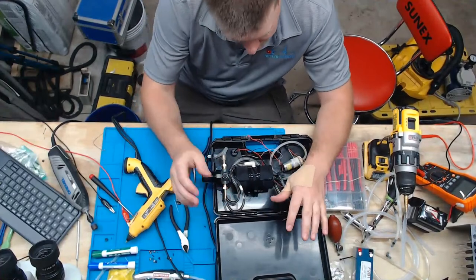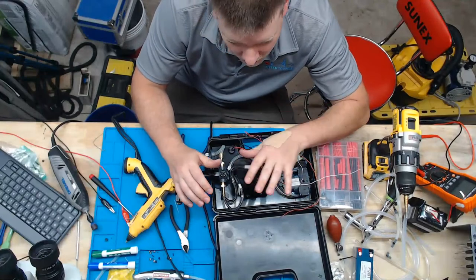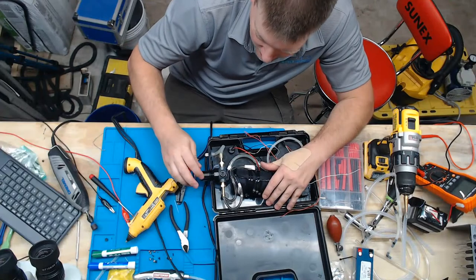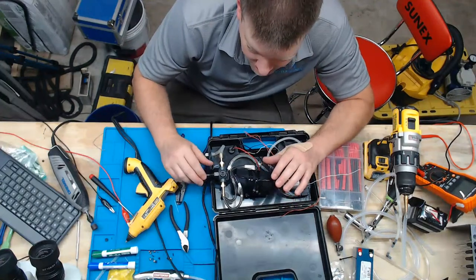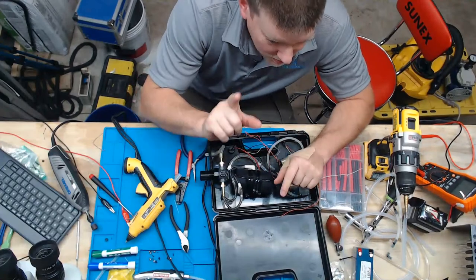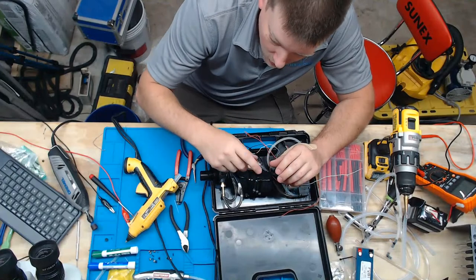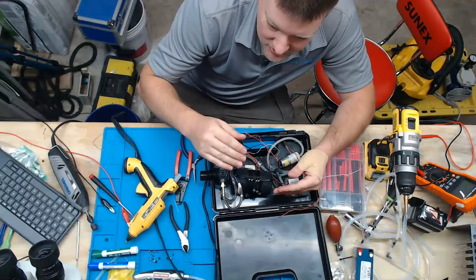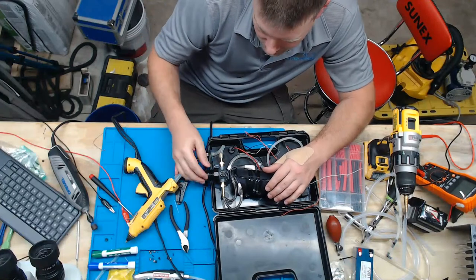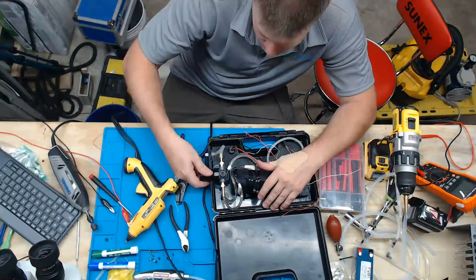But the point being for this device is that you have a portable air compressor that has an adjustable regulator. And this regulator here is 0 PSI to 15 PSI, which is not much, but you don't want it to be much because you need that resolution for reaching all these different pressures for calibrating medical equipment. So let's say in order to calibrate a medical device, you need it to go to 100 millimeters of mercury.